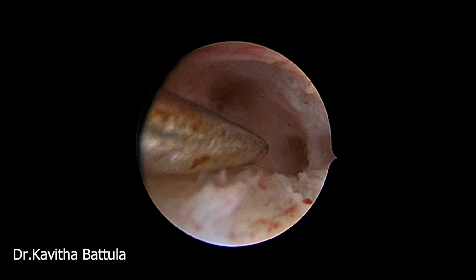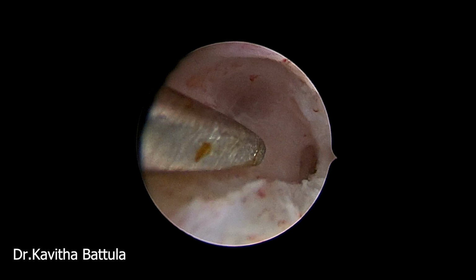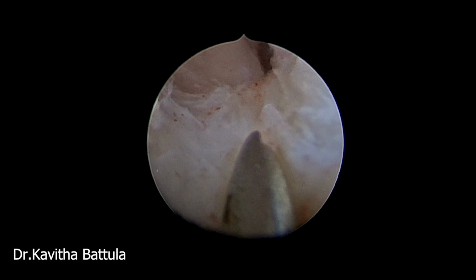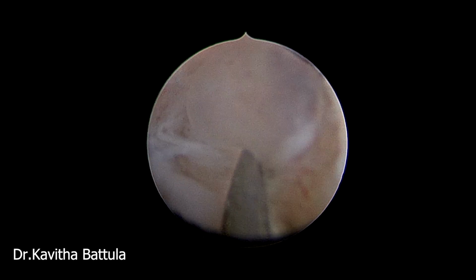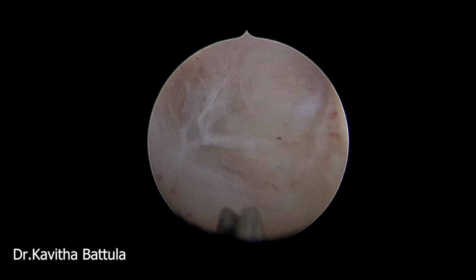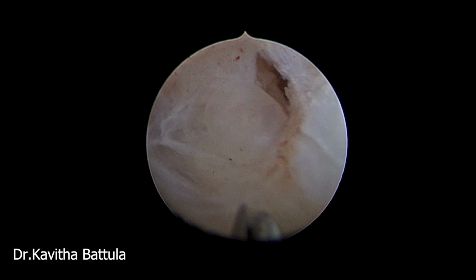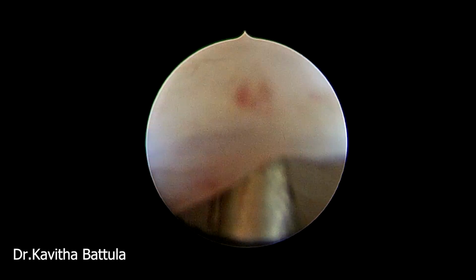Another thing is, once we incise and there is a small entry into the cavity, the normal uterine cavity enlarges and the entry becomes a bit enlarged. So we can identify the correct uterine cavity and the correct path. Here we are trying to identify which one is the correct cavity or the entry.